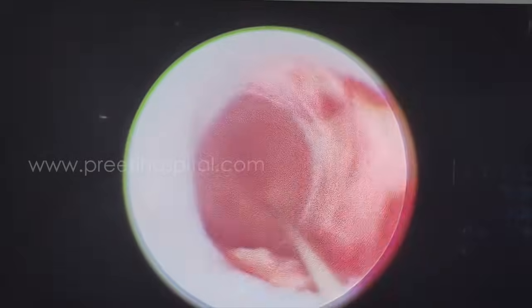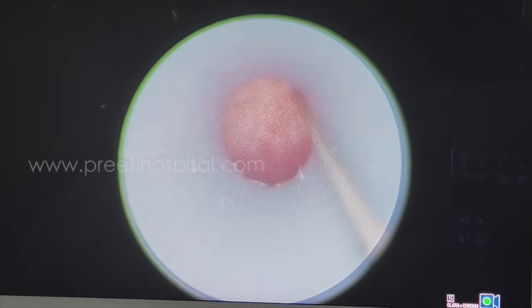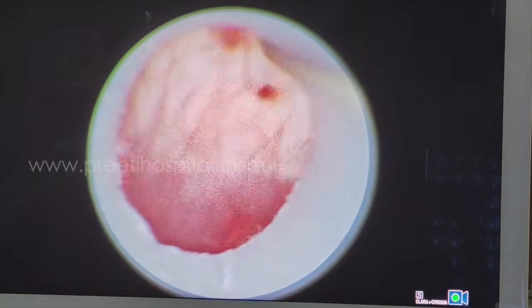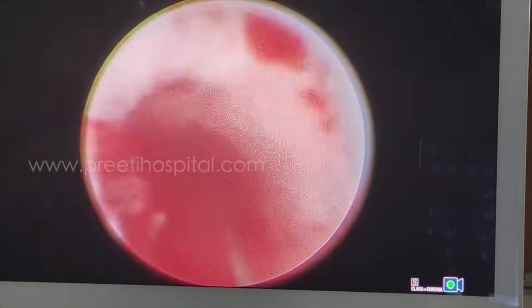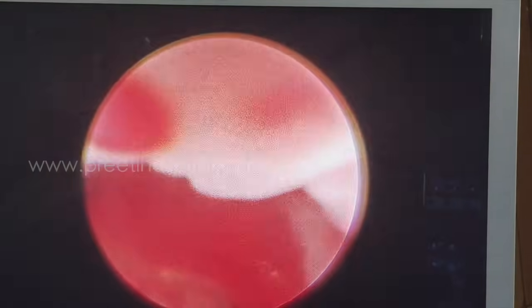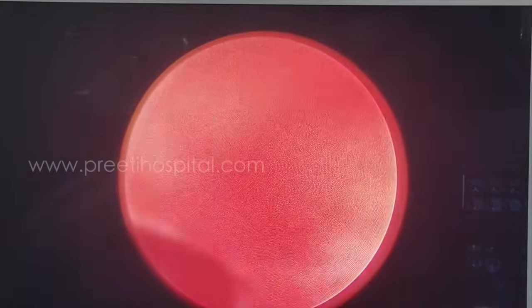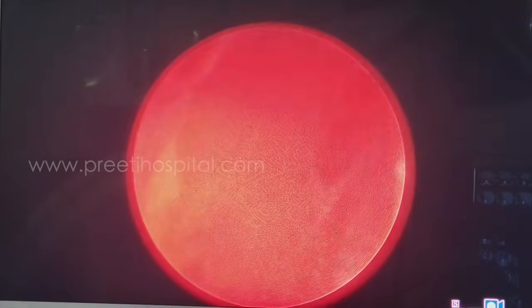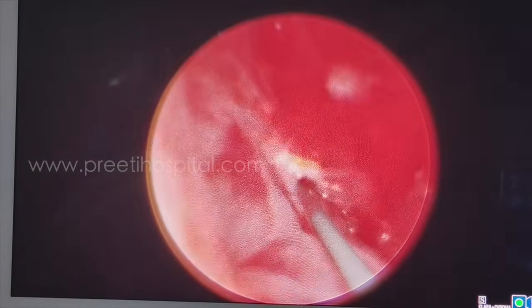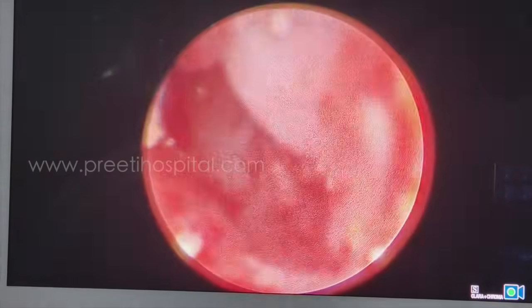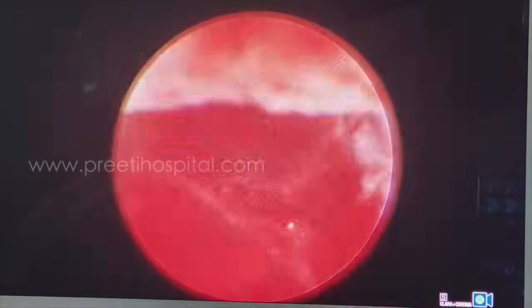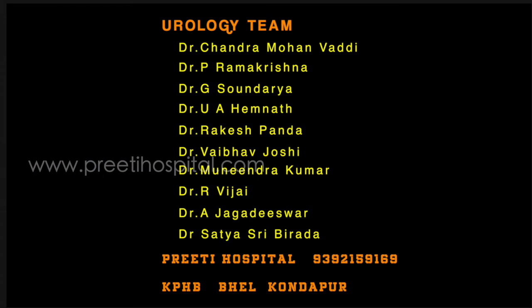This is the entry point. This is the middle posterior calyx. From here, this is the pelvis, and this is the PUJ. From here, part of this is the isthmus region. This is the pelvis, this is the ureter, this is the ureteric catheter.